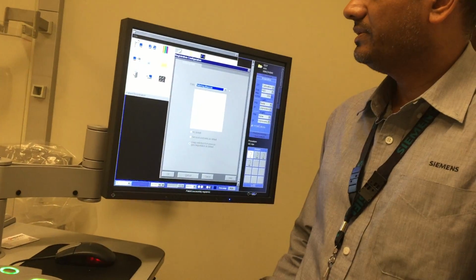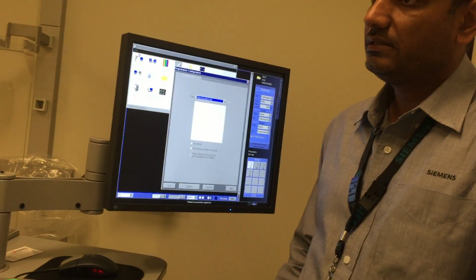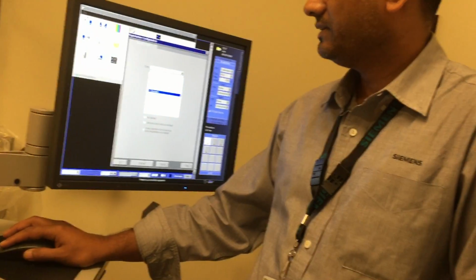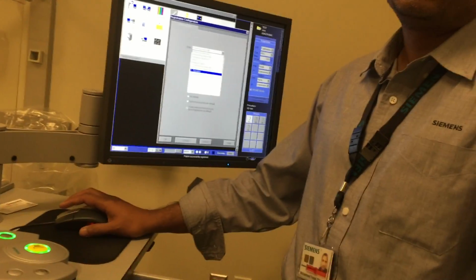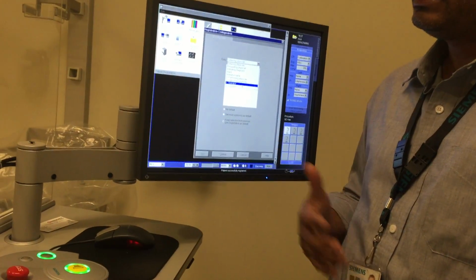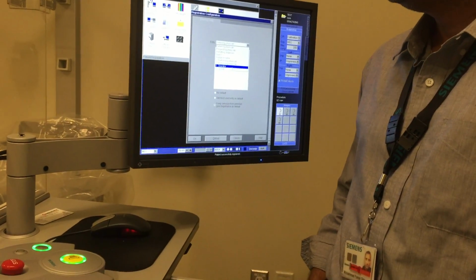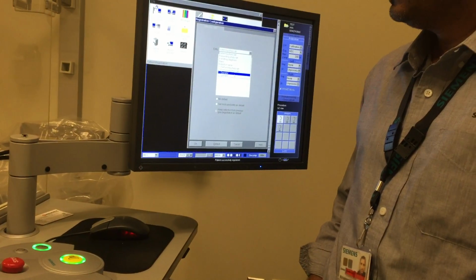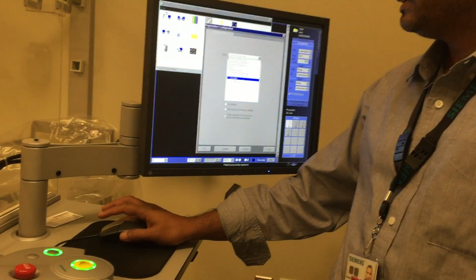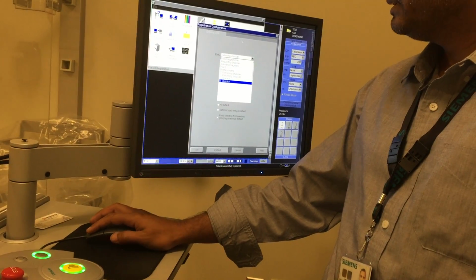And then once the patient study goes to the PACS, they know actually which technologist, they know by initial, because they can set up their initial. Let's say Jessica. Right. So they can put the Jessica name, and then once she logs in as Jessica, it will be tagged with the patient study, and then they will know which operator has done this procedure. Same way for the physician as well, and all this institution name, ward, all this information you can put in.